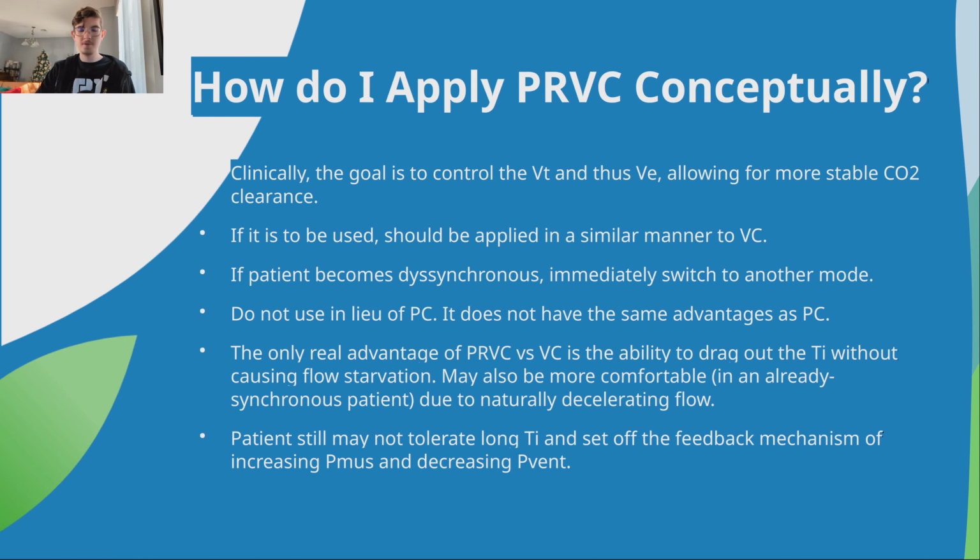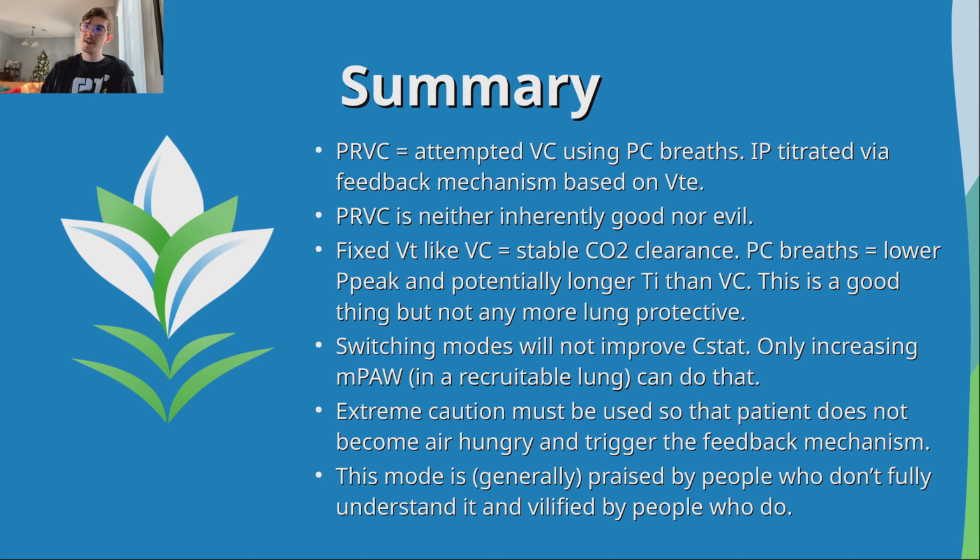Okay? Do not get it twisted. Do not treat this like pressure control. It is not pressure control. So, summary here. PRVC is basically attempted volume control using pressure-controlled breaths.